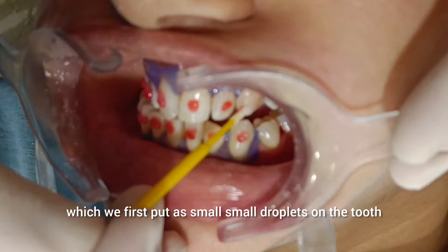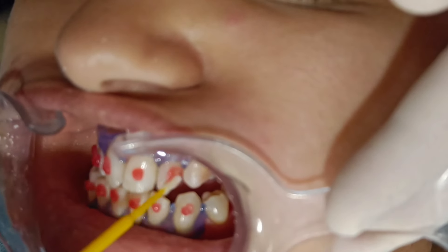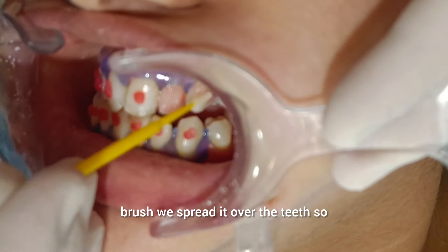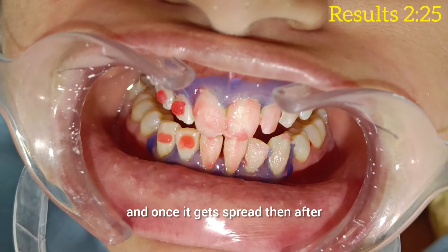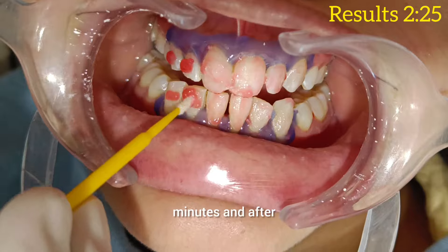We put small droplets on the tooth, and after that we spread it over the teeth so that it will activate. Once it spreads, we leave it like this for around 10 to 15 minutes.